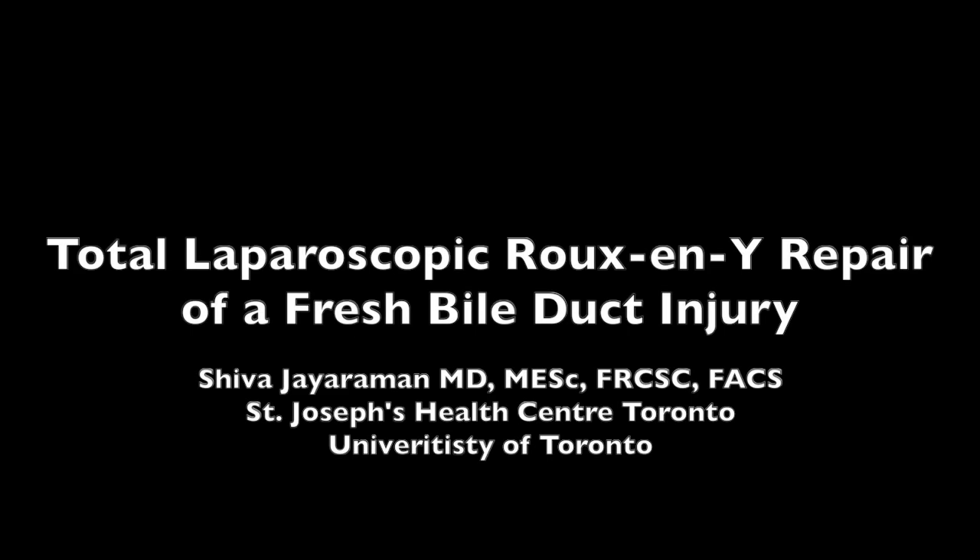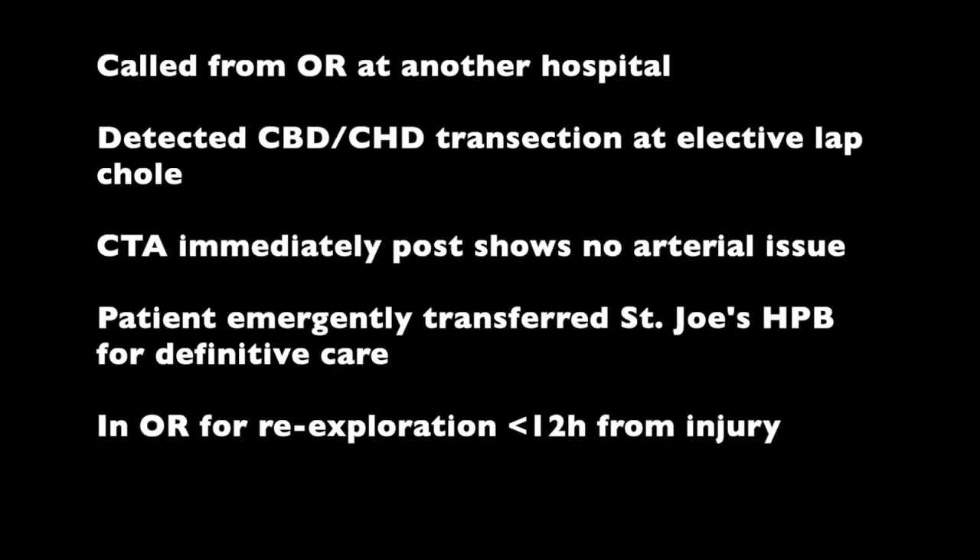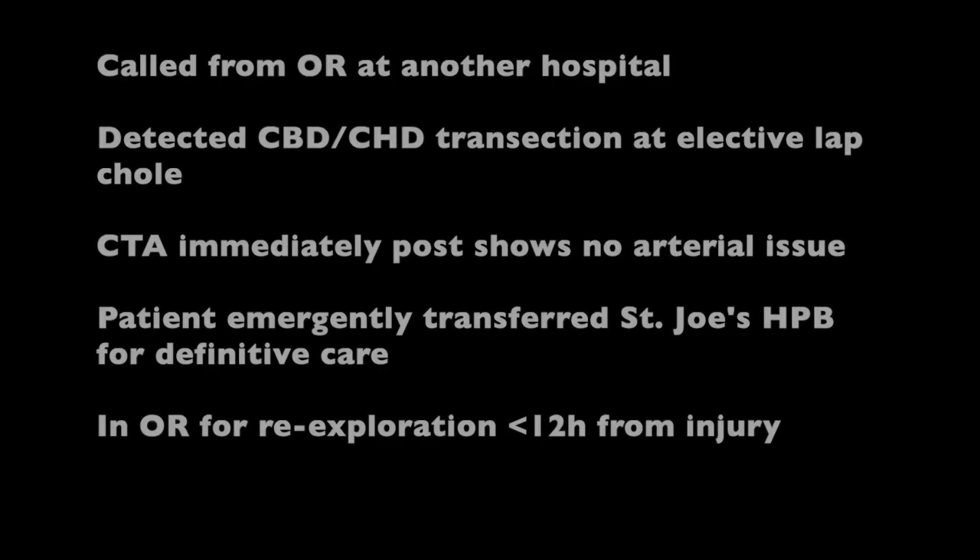This is a patient who was transferred to our care with a fresh bile duct injury from another institution. After ruling out arterial injury quickly after surgery, the patient was transferred for emergency and definitive care.